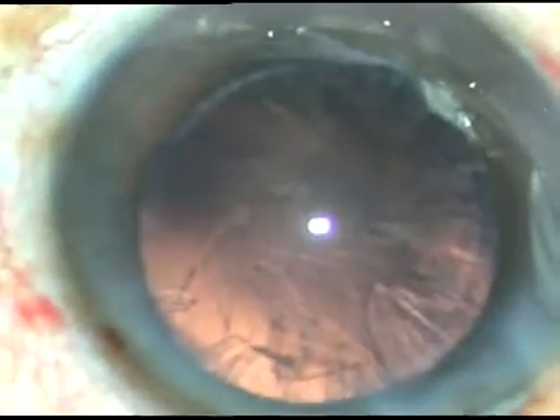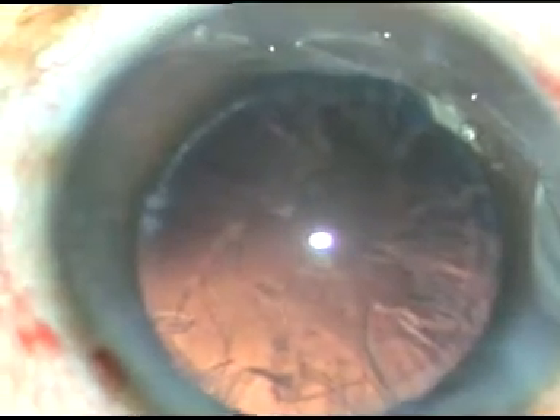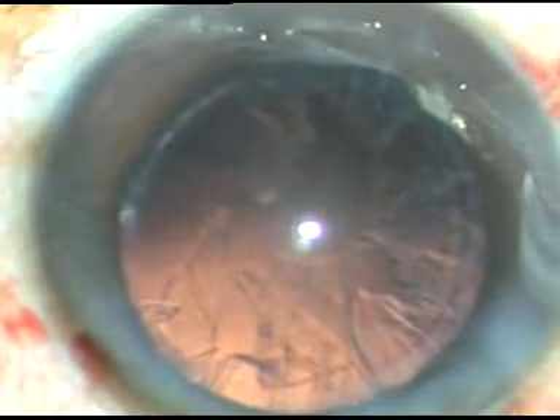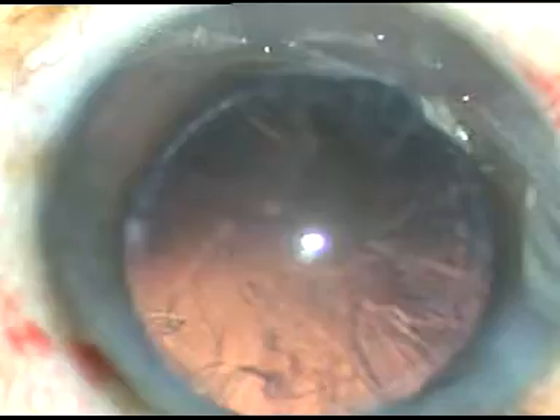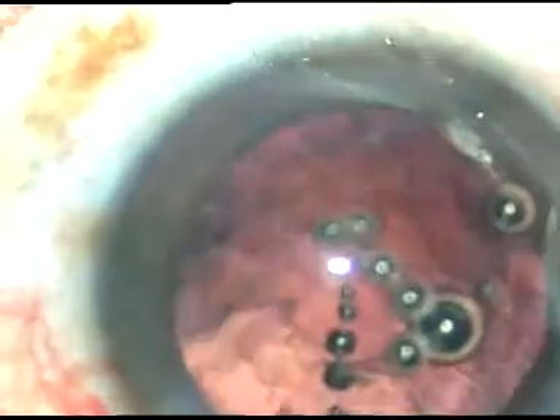I call it the lens tilt technique, since the lens is tilted by hydrodissection. Now some cortical lens matter remains — not much. I am going to inject some viscoelastic substance, and in this case I have taken a Simcoe cannula to remove this cortical lens matter.